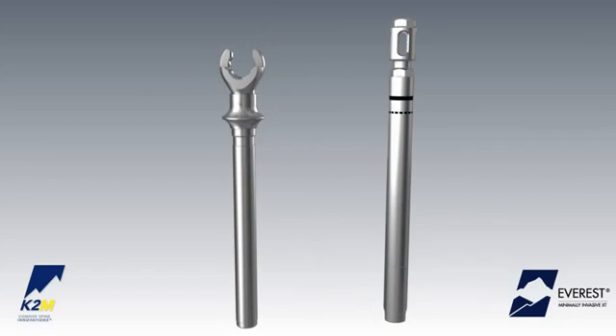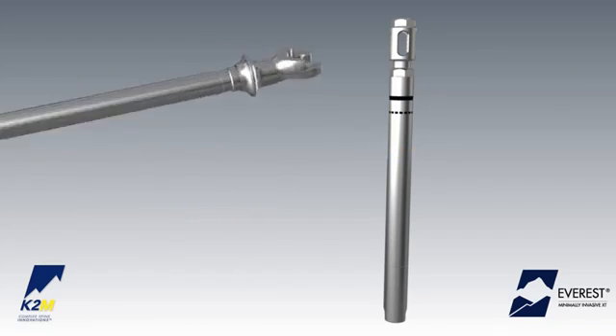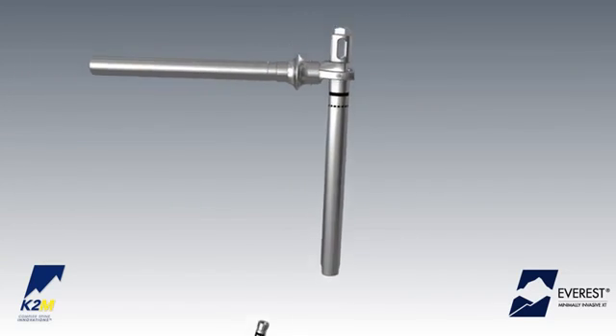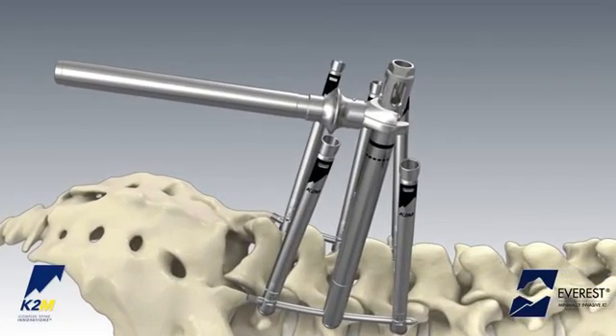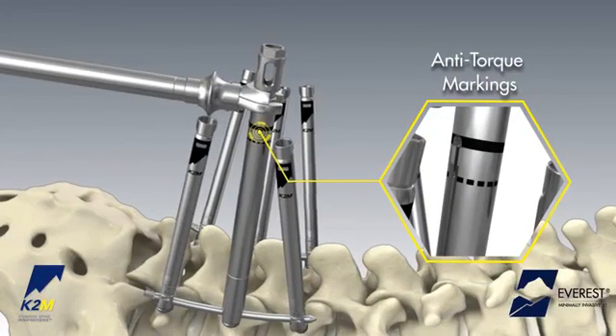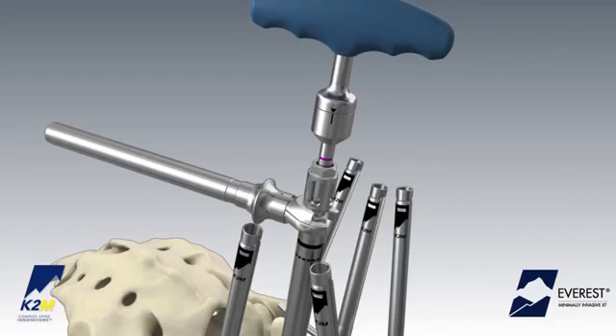In addition to the tab reduction tunnel, final tightening may also be achieved by using the anti-torque handle and the stabilization tube. Attach the anti-torque handle to the stabilization tube and slide it over the extension tabs until fully seated over the XT screw. External markings indicate proper alignment. Insert the torque indicating wrench into the cannula of the stabilization tube to complete final tightening.